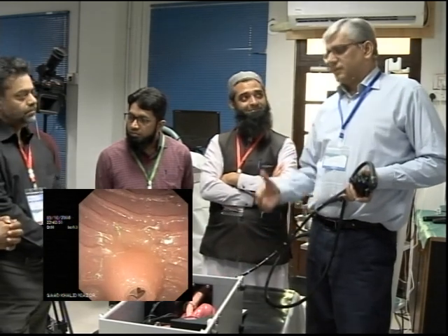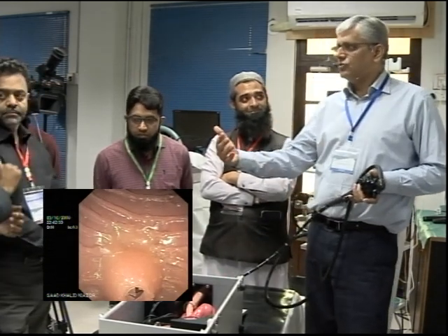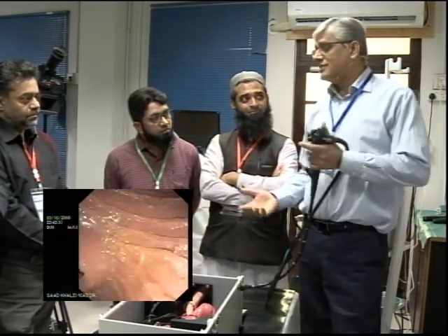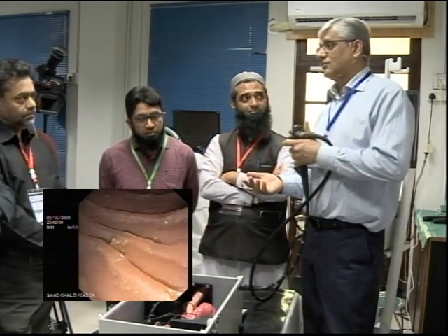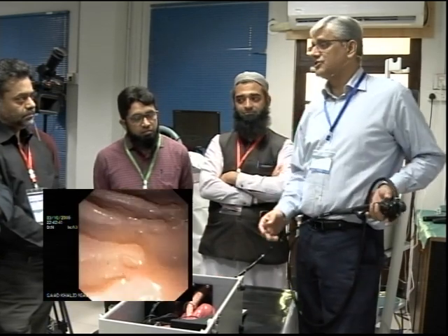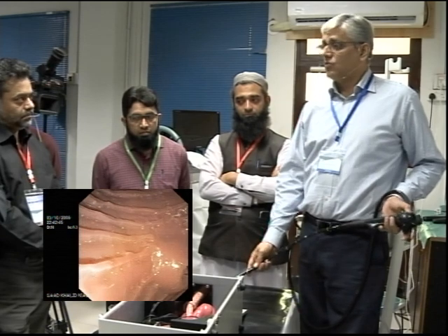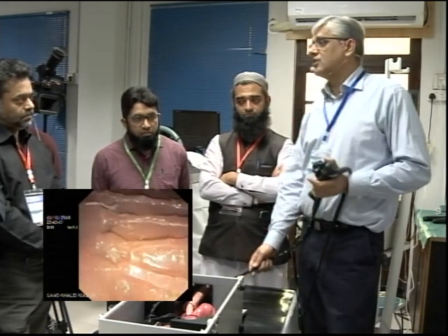So what you need to do is, when you go back, see what is happening. What are you doing to change the position? What happens when you go here? What happens when you go anti-clock? What happens when you go in? What happens when you come out?